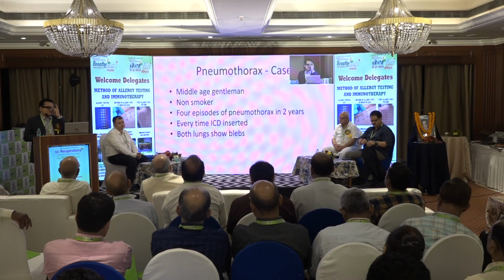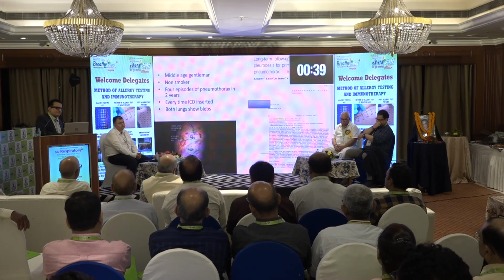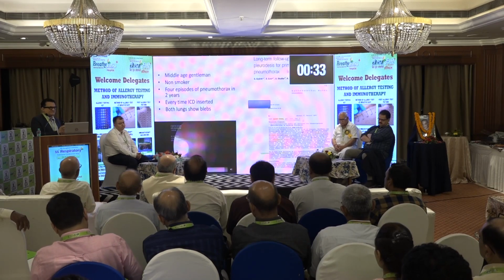Last case and last 2 slides. Pneumothorax, middle-aged gentleman, non-smoker, 4 episodes of pneumothorax in 2 years. Every time an ICD is inserted, he's admitted for 1 week, the lung expands and he goes back, and comes back after 6 months. This time he comes to us with the ICD. Okay? And what we did for this patient is, this is a pleuroscopy we did for this particular patient here. And if you see here, after pleuroscopy, we did a talc pleurodesis for this patient.